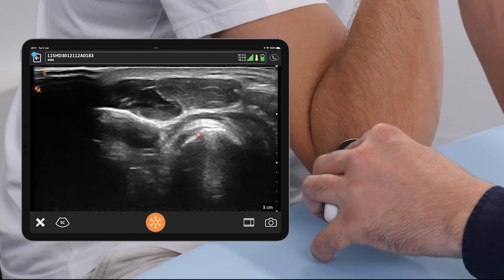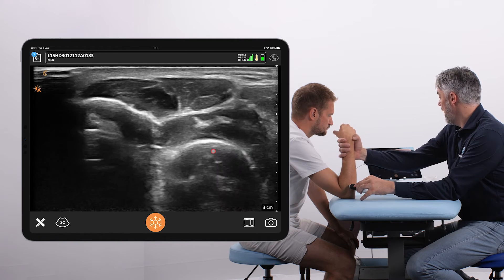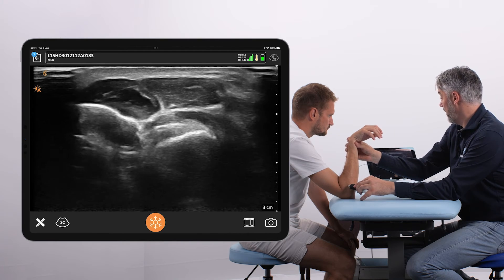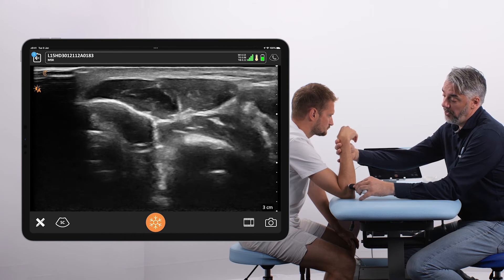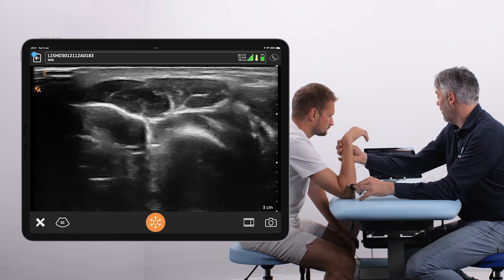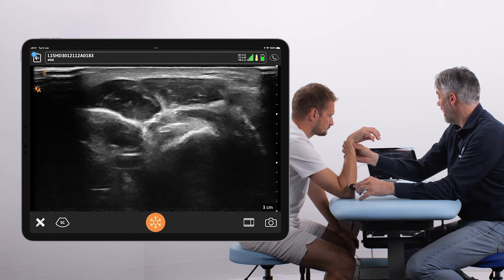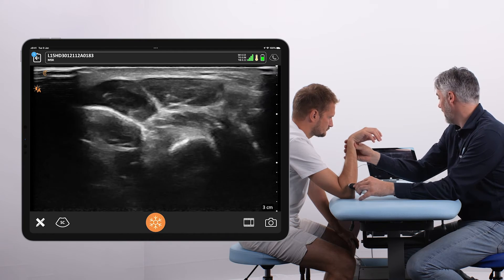We're not only assessing the static position but also the dynamic position. Pay attention to whether you see the tendon, and also check for a bursa — bicipitoradial bursitis could be present. Also look for any signs of impingement, which could occur between the radius and ulna within the radioulnar joint, for example due to a calcification.